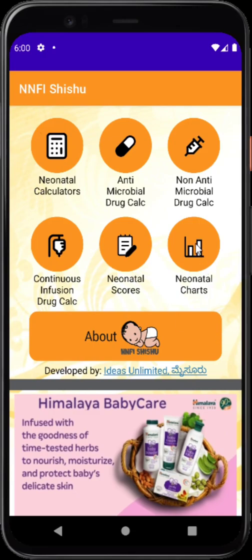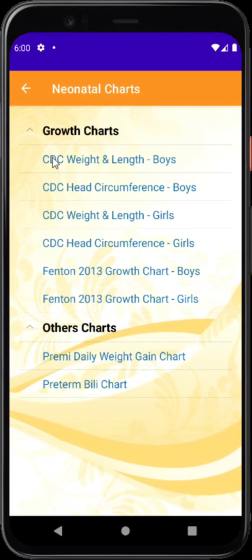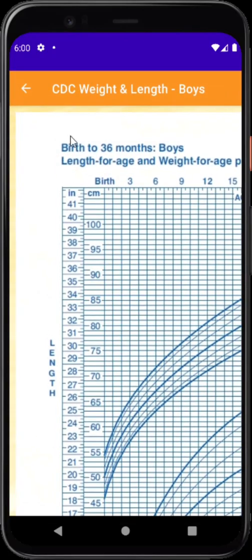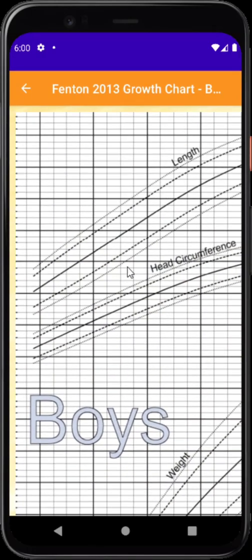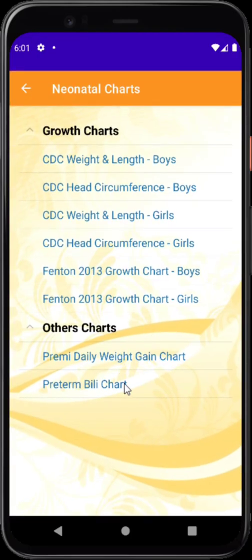Moving to neonatal charts — there are static charts where you can view and zoom the image for plotting. For example, Fenton's growth chart is available. There are also two important interactive charts, particularly useful when babies stay in the unit for a longer time, especially premature babies where weight gain is a key issue.